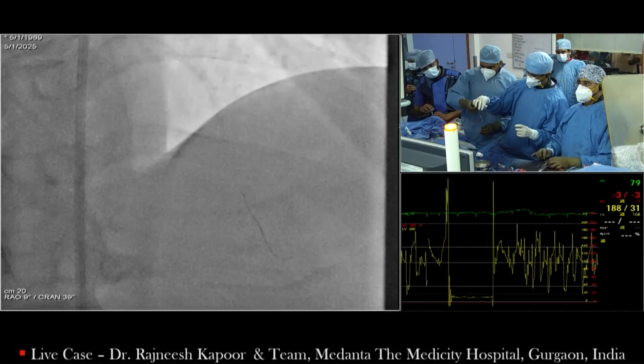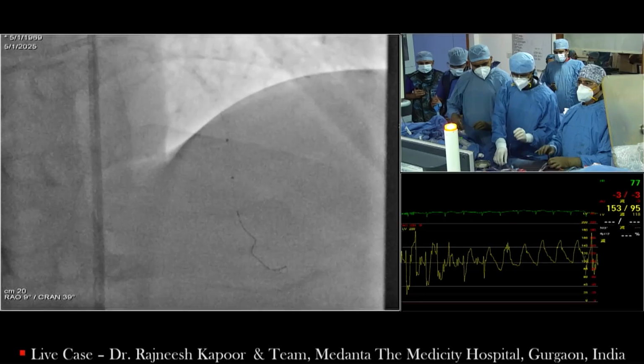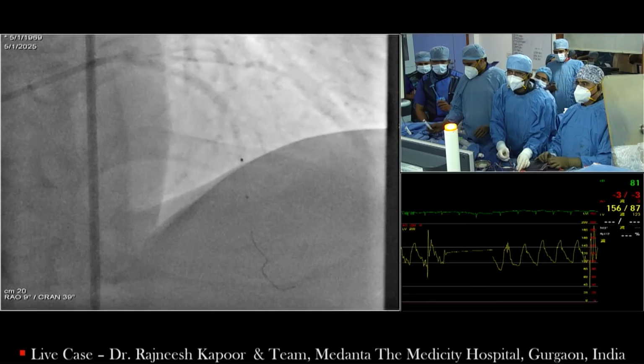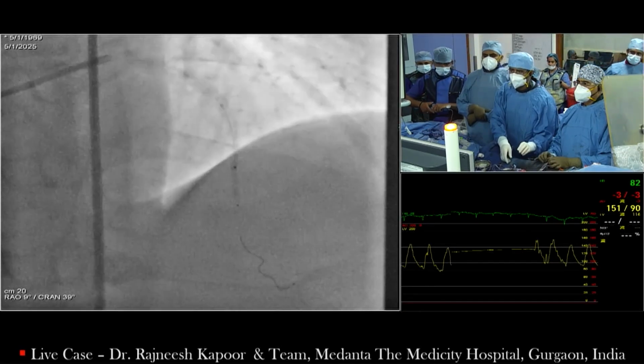One question I wanted to ask before Rajneesh took the orbital atherectomy: if you look at the OCT images, it looks like there is superficial calcification and deep calcification. Will that make your choice in terms of what device you use?